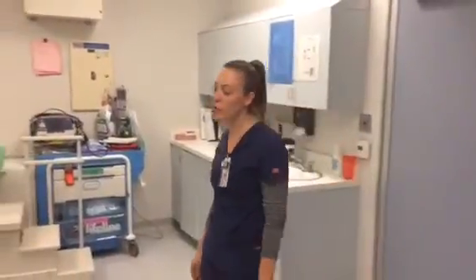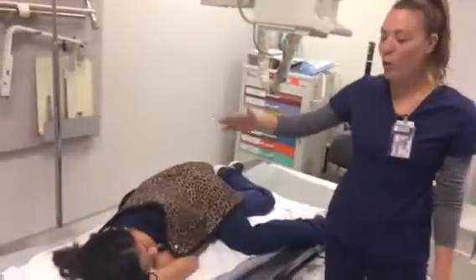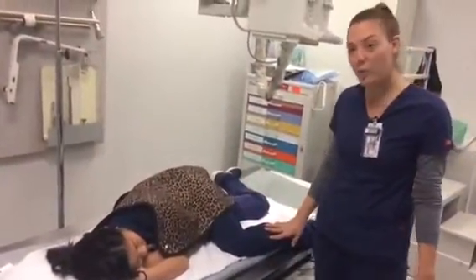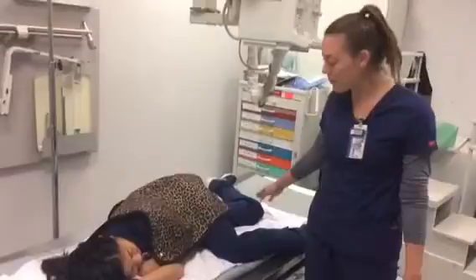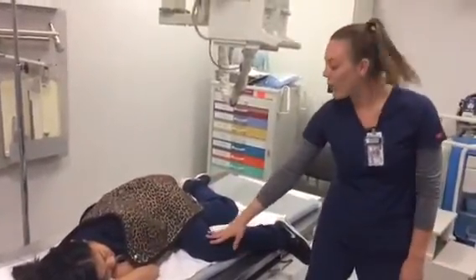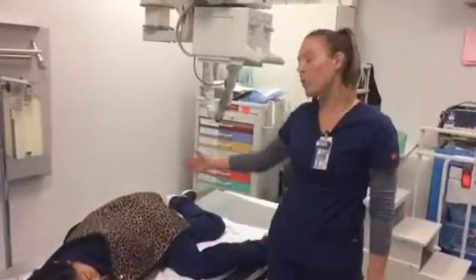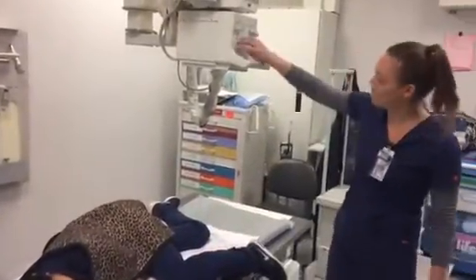All right, so the next projection is going to be the lateral projection of the knee. So we've asked our patient to roll over onto the affected side, which in this case is the right knee. We have shielded our patient and had them comfortably rest themselves with the unaffected side in front. You can also do it in back too, whatever's comfortable for them.